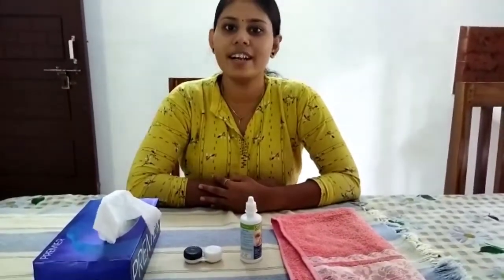Hi all, I am Jidda, pursuing Fellowship in Contact Lens Dispensing under the Indian Academy of Optometry. In this video, I am going to demonstrate insertion and removal of soft contact lens.